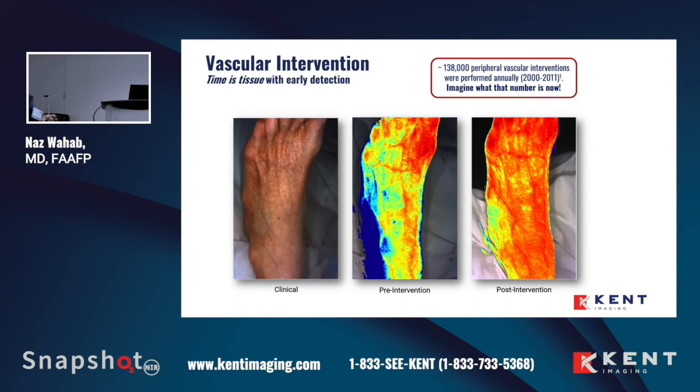Pre-intervention, we can see that there is a significant decrease in oxygenation here. I caution those of you who are using the technology for the first time and only looking at colors. I do think that the colors can be somewhat deceiving. And so actually putting, it's a touch screen, so putting your fingers or a stylus to actually check the areas of oxygenation is very, very important. It's important to also check the surrounding tissues as well, and to really get an average of the entire area.